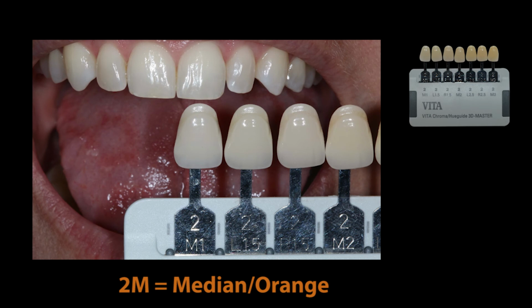Now that we talked about how to pick the value and we settled on a value group 2, let's talk about the next step. So step 2 is how do we pick our hue and chroma. So let's start with our hue. So we know we picked a value group 2. If you notice on the upper right, you're going to see a picture of the shade guide that I'm using. Now remember, this is a 3D Master shade guide in a linear form that we're referencing. So I'm going to grab the value group 2 shade guide.